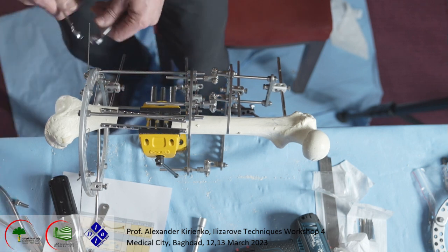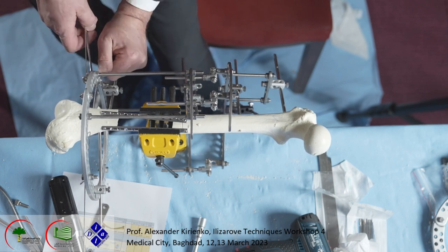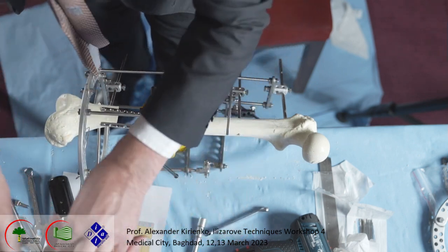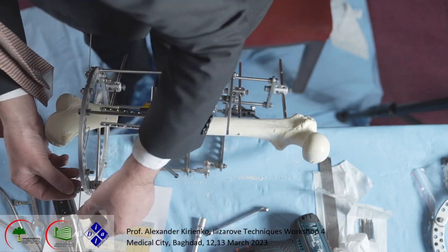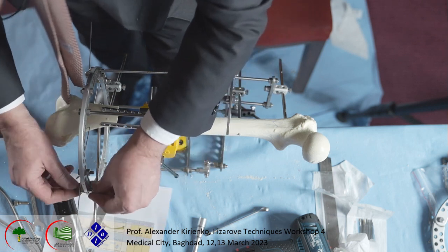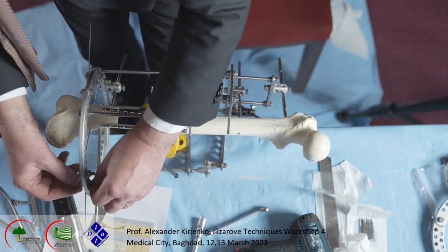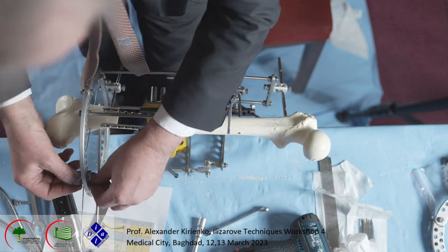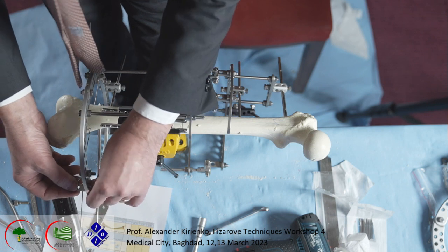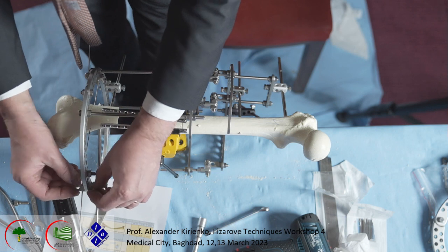The same, like I said before, you might do tension with a post, but we don't do it always. We do better here with a tensioner. Now we position another post here. So always with the hole. No, we don't need the hole here. We look for the free holes here. Much more comfortable here, and I put a washer. Maybe we have one washer.